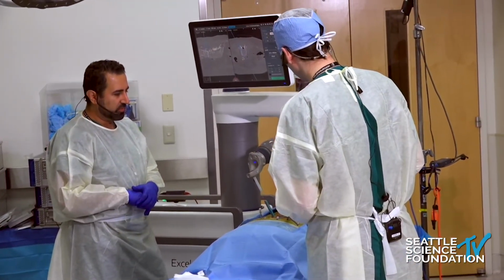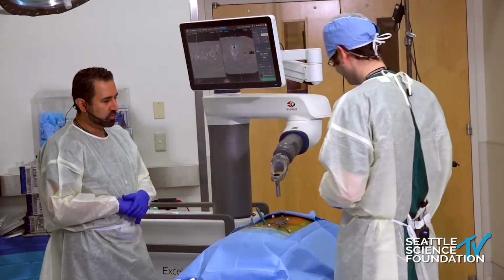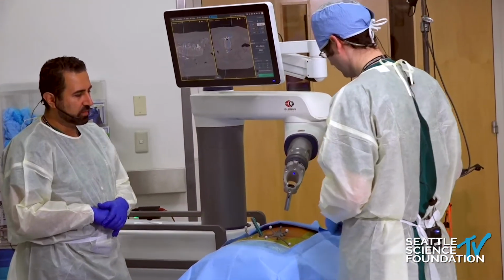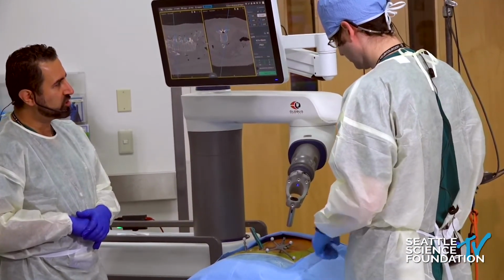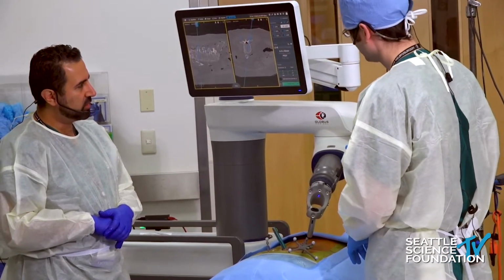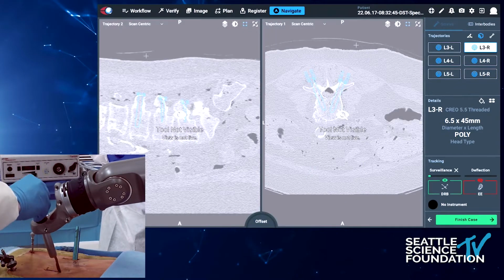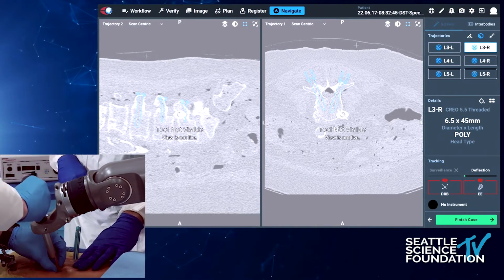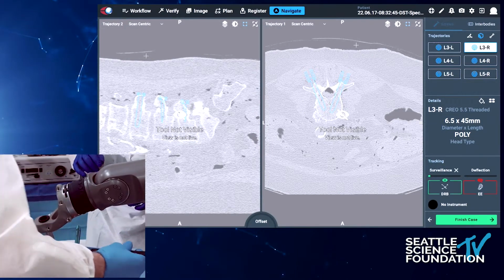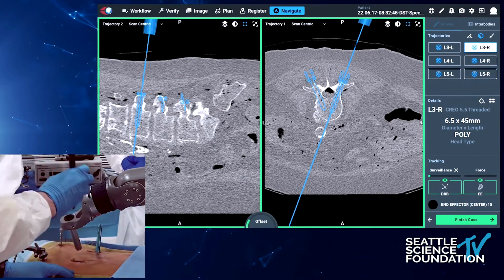This is the part that I love, the ability of the robot to keep to target and keep to plan. And if there is a shift or excessive pressure that's applied, then there's a meter or metric for that. Slight adjustment. You can even extend the incision if you want a little bit, and that's what it lets you do. Perfect. I'll make it easier.